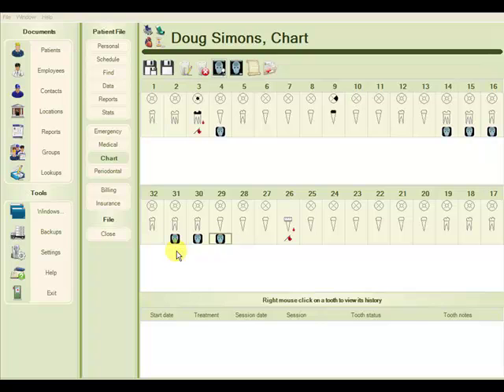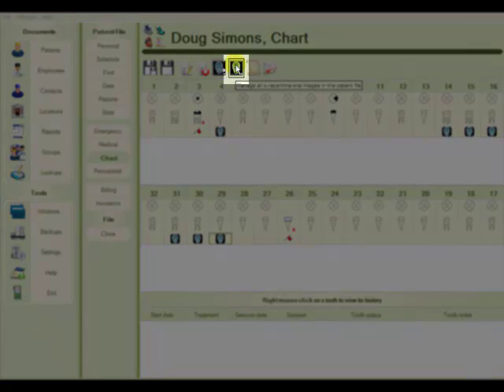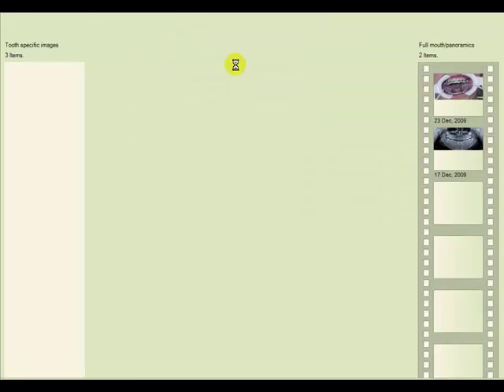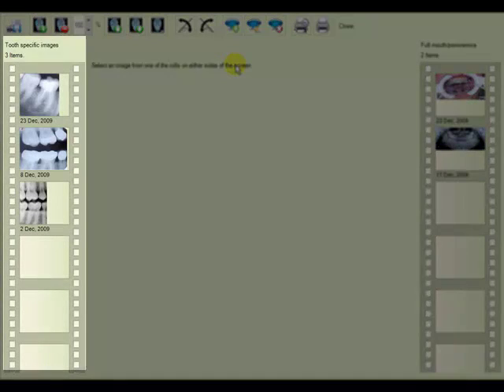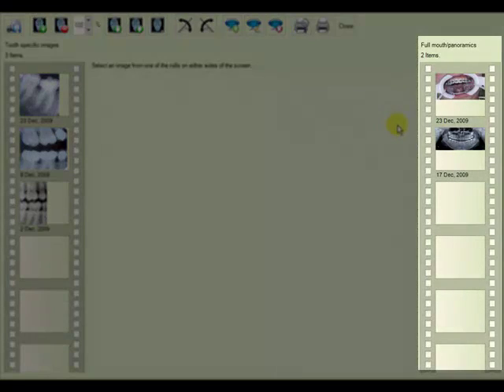Again at the top toolbar, if we look at manage all X-rays and images in this patient file, we now see on the film strip all of the X-rays and intraoral images for this particular patient. The images linked to individual teeth are found on the left, while the panoramic images are displayed on the right.